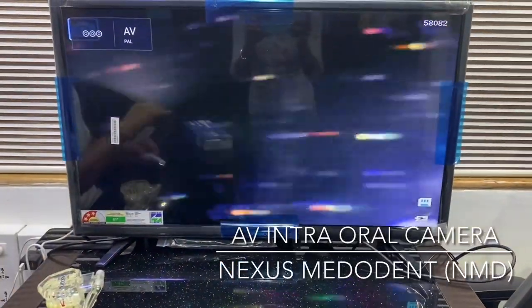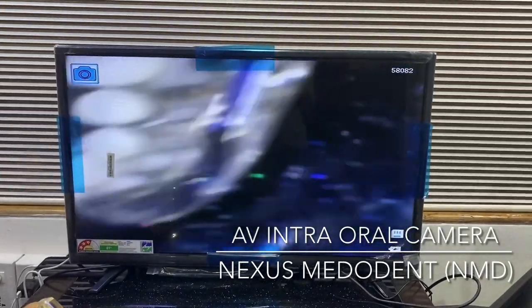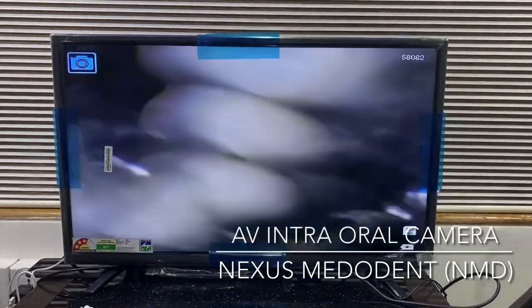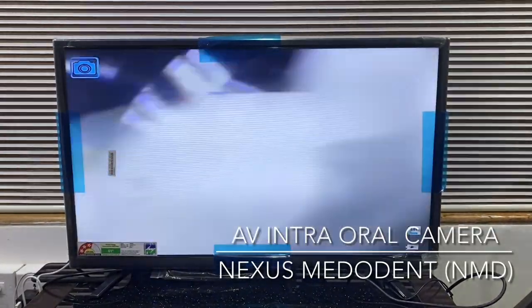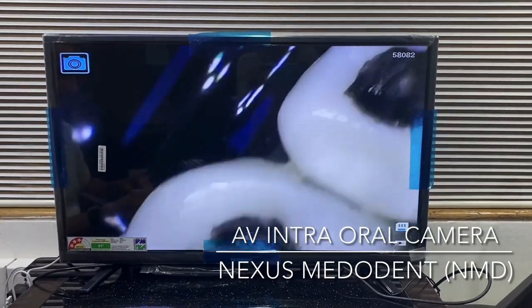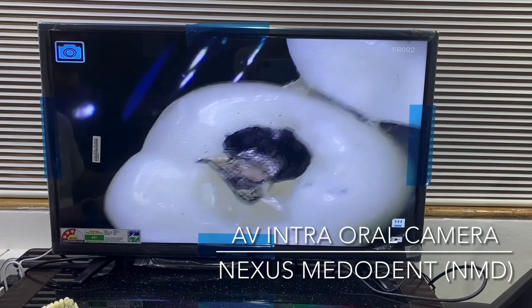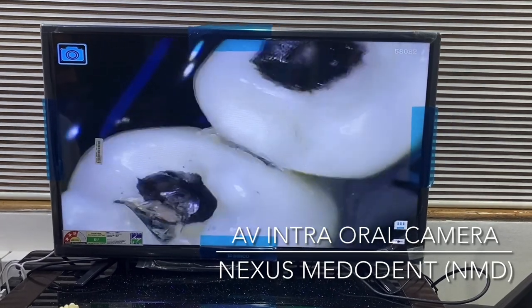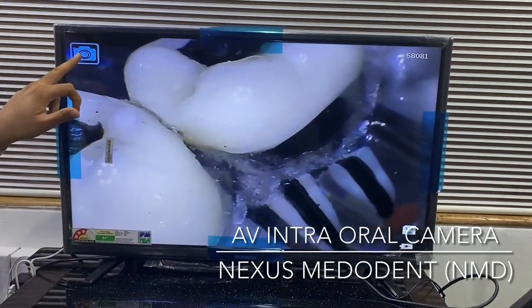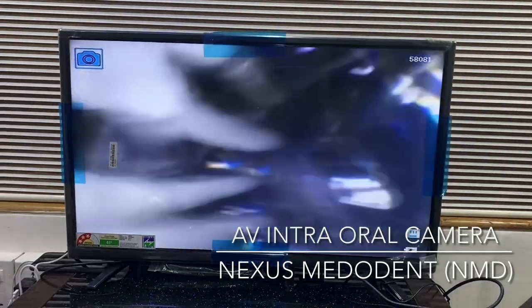The camera is on right now. We have a model here — an all-in-one model, also available from us at NMD. You can see the clarity is very clear. If you want to take multiple shots, all you have to do is hit capture. When you hit capture, you can see this icon will change, which means the image is already captured.